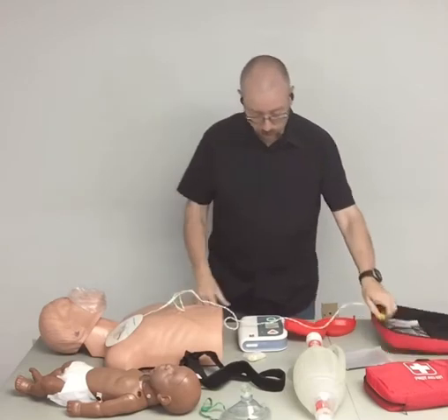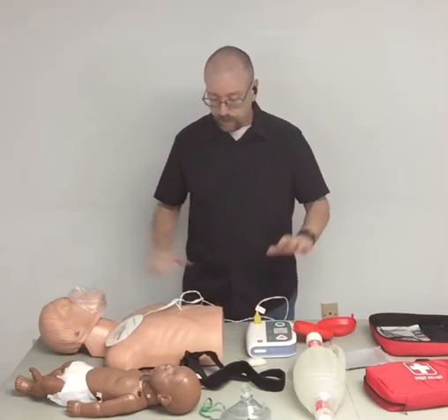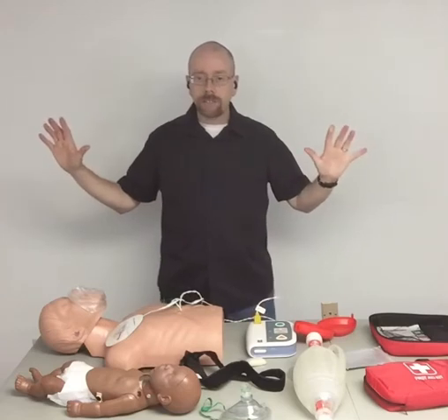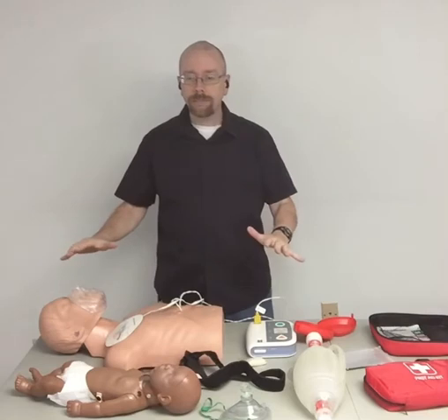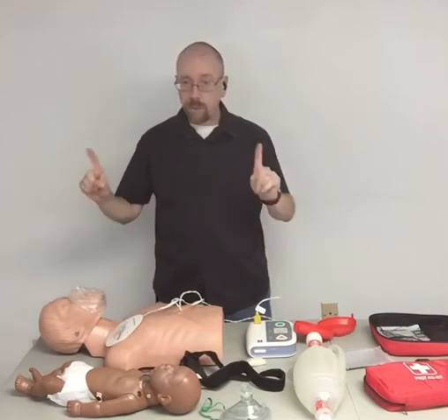Apply pads. Plug in connector. Plug in the pads. Analyzing heart rhythm. Everybody stand clear. Do not touch the patient. No contact. Shock advised. So it's a shockable rhythm.